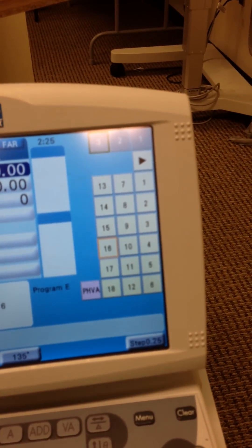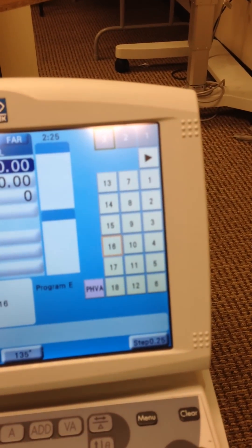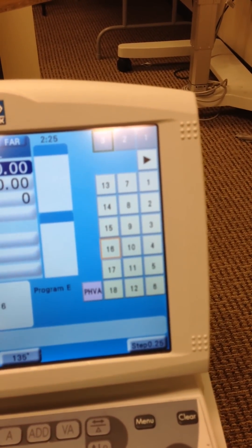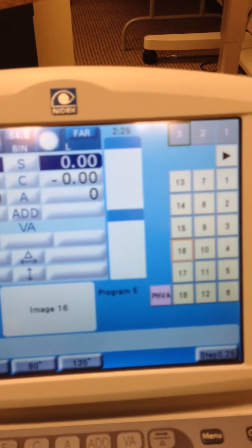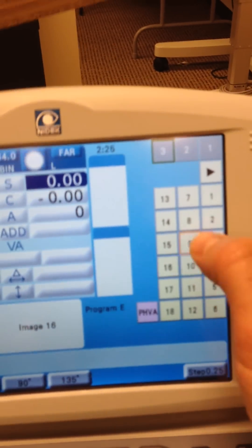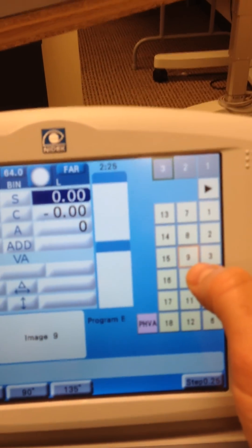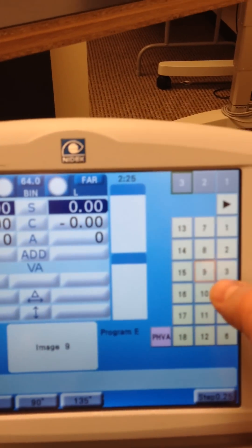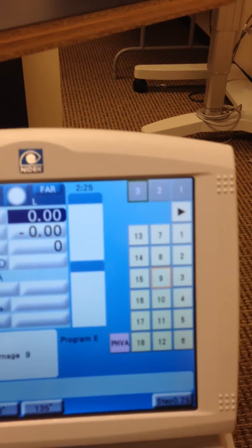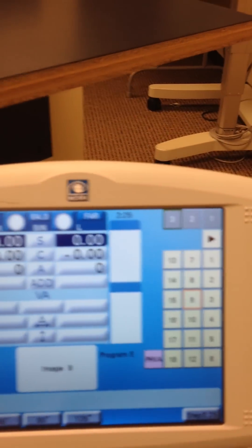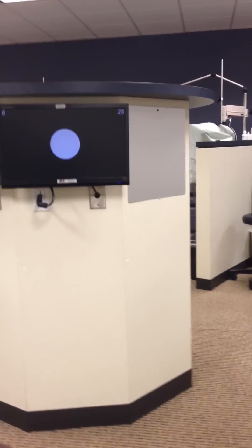Now, if we want to do contrast, there are a couple ways we can do it as well. And I think if we press on the panel here, number 9 on tab 3 is going to show you the grading type of contrast. And what you'll see, if we approach the screen, is that up in the upper left-hand corner, there's a number of cycles per degree. This is 6 cycles per degree.